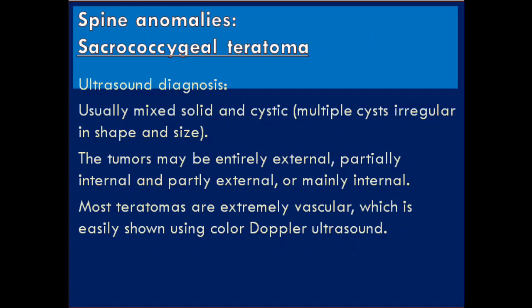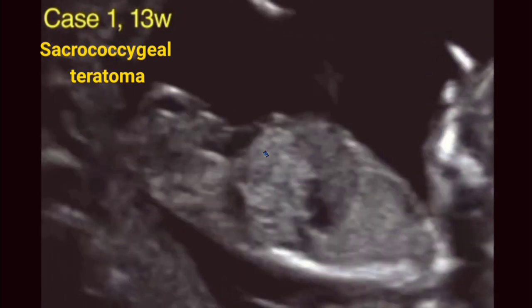The next abnormality is sacrococcygeal teratoma — ultrasound diagnosis. It usually appears as a mixed solid and cystic mass with multiple cysts, irregular in shape and size. The tumor may be entirely external, partially internal and partly external, or mainly internal. Most teratomas are extremely vascular, which is easily shown using color Doppler ultrasound.